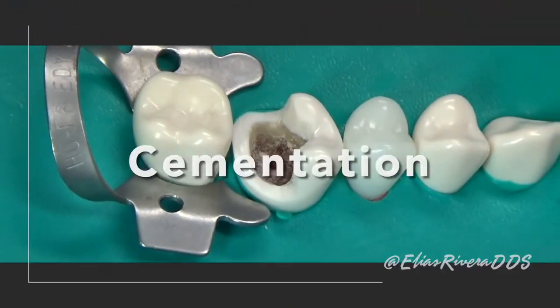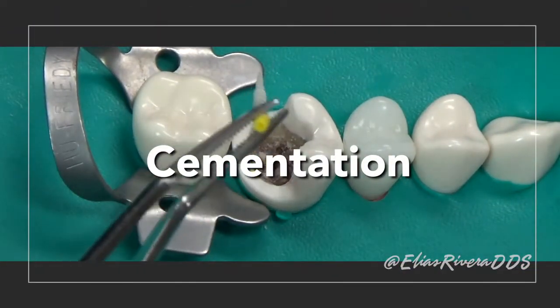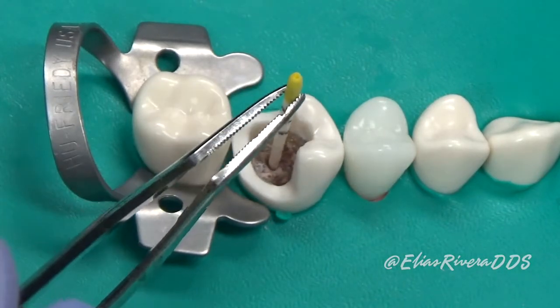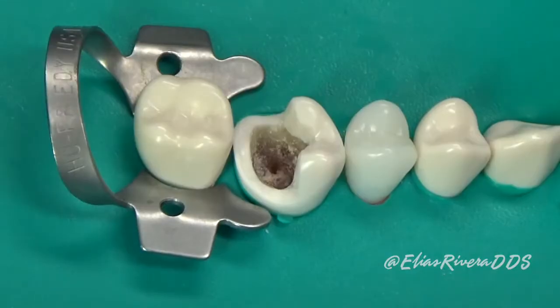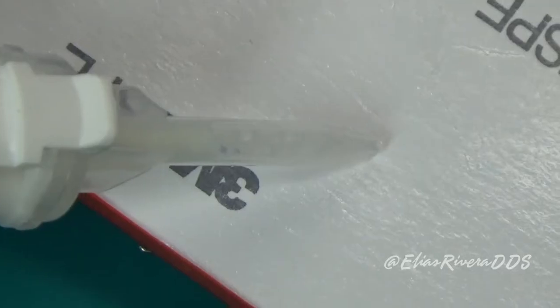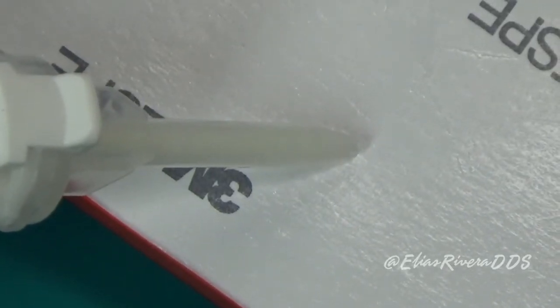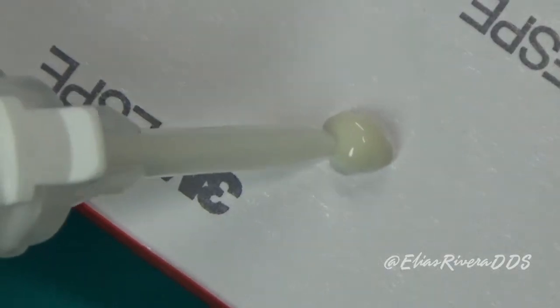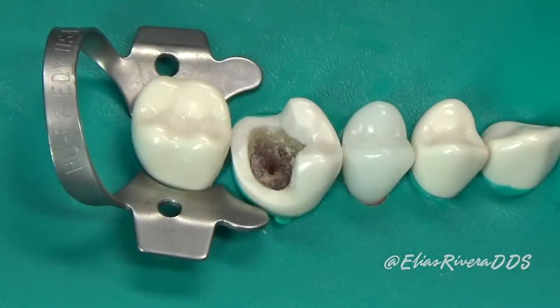Now we're going to proceed with cementation. To do this, the first thing we need to do is dry the canals really well — for this we're going to use paper points. Then we're going to place a little bit of cement on a plate. After that, we're going to use a lentulo spiral to place the cement inside the canal.